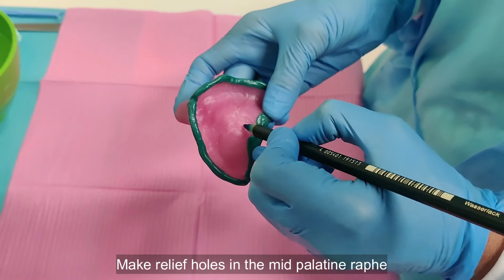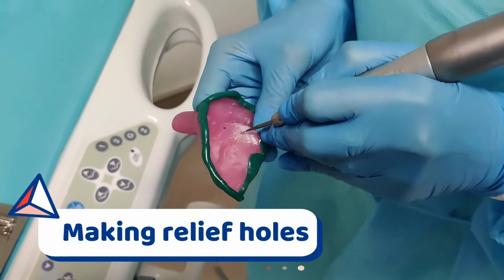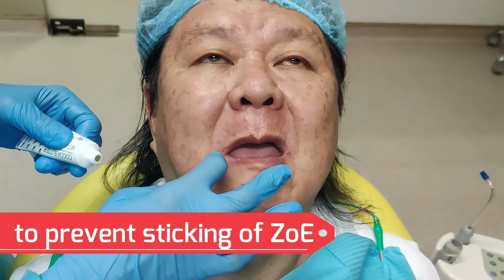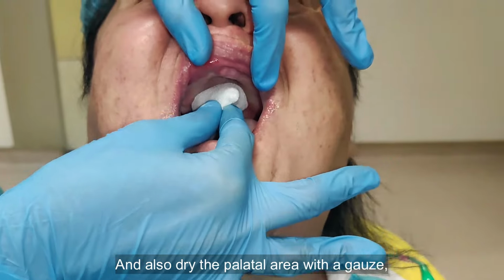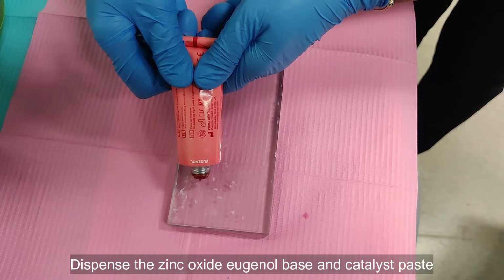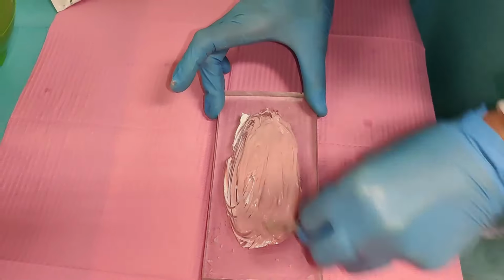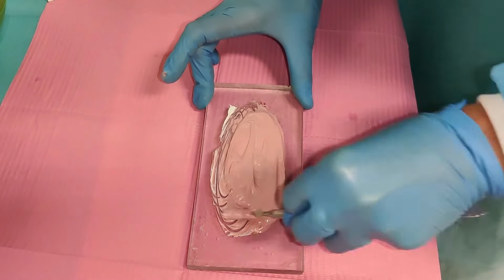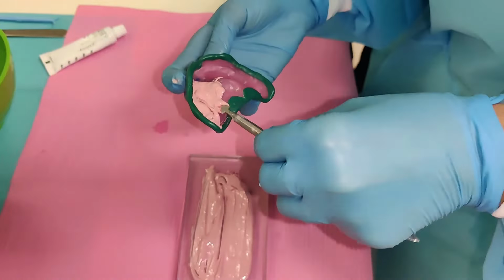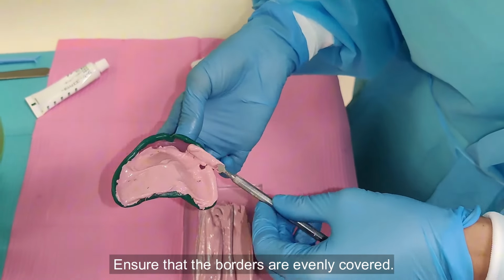Make relief holes in the mid-palatine raphe and the incisive papilla region. And also dry the palatal area with a gauze prior to making the impression. Dispense the zinc oxide eugenol base and catalyst paste of equal length. Mix the material homogeneously and load the tray. Ensure that the borders are evenly covered.